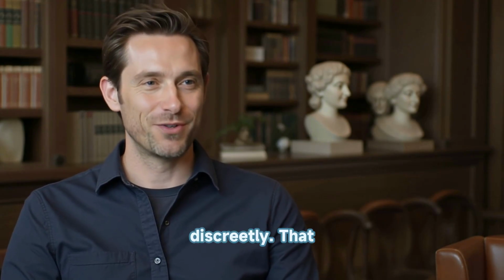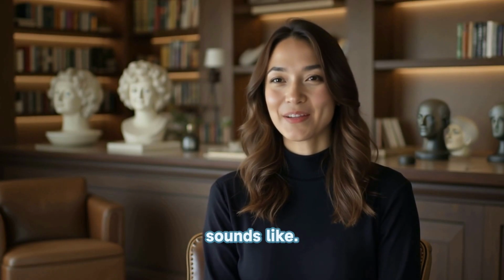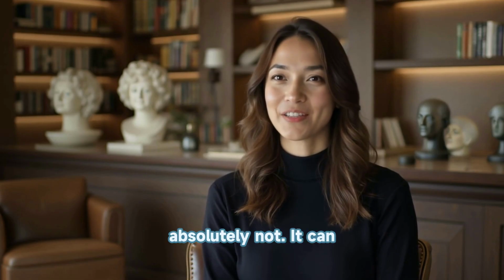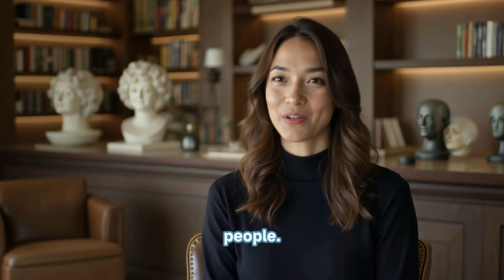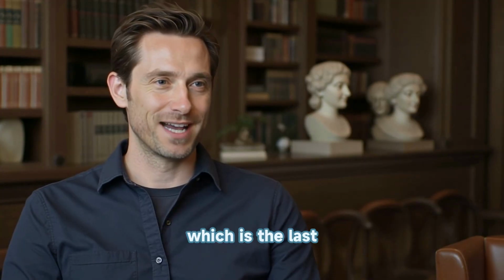Managing gas discreetly. That makes me think about the problem it's trying to prevent. There was a term in the sources: ballooning. Yes, ballooning. It's pretty much what it sounds like, the bag inflating. Gas builds up inside the pouch, maybe faster than it can escape, and the bag starts to puff out like a little balloon. I can definitely see why you wouldn't want it. Oh, absolutely not. It can feel uncomfortable, for one. It might be noticeable under your clothes, which understandably causes anxiety for a lot of people. And sometimes that pressure buildup can even put a strain on the seal, how the bag sticks to your skin. Right, which is the last thing you need.